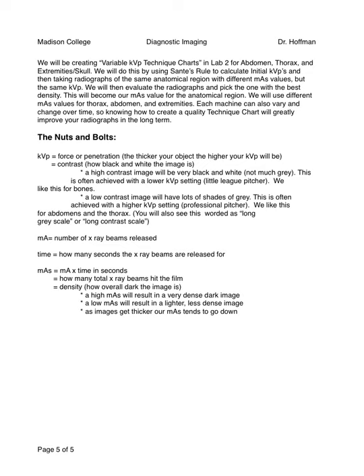And then the nuts and bolts here, guys, I broke it down for you, what you really need to remember: that KVP is force. The thicker the object, the higher your KVP is going to need to be. It's going to affect contrast, how black and white the image is. So remember when we looked at those x-rays, things were either white or they were black. Big changes are happening when we're looking at KVP. Contrast is a word you're going to want to associate with KVP.